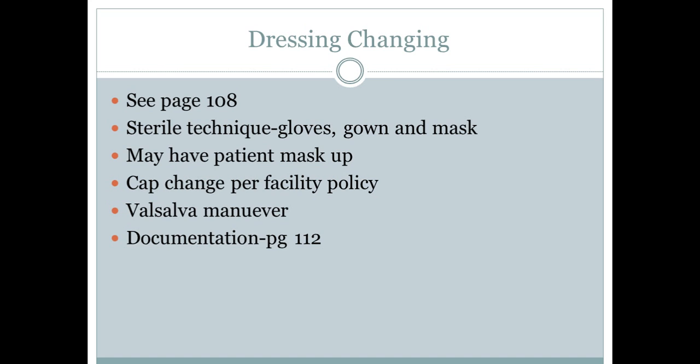You're going to open the bag and place it away from the sterile field, but still within reach. So this is going to draw upon your knowledge that you learned from nursing school of creating a sterile field and not contaminating it. Obviously, if you contaminate it, you'll have to start over. We're going to put on just regular clean gloves when we take off the dressing. However, after we remove that old dressing, that's when we're going to remove our gloves and wash our hands if we can, and then put on our sterile gloves.